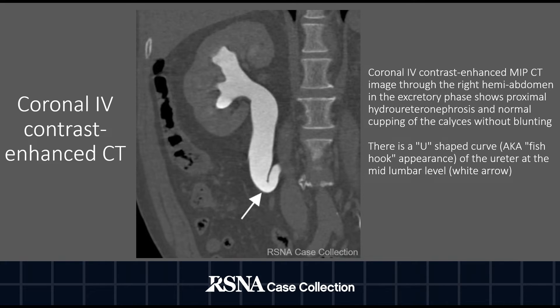Coronal IV contrast-enhanced MIP CT image through the right hemi-abdomen in the excretory phase shows proximal hydroureteronephrosis and normal cupping of the calyces without blunting. There is a U-shaped curve, also known as the fishhook appearance, of the right ureter at the mid-lumbar level, as indicated by the white arrow.